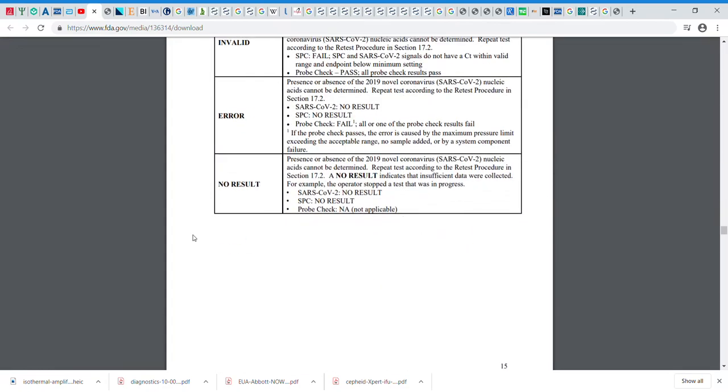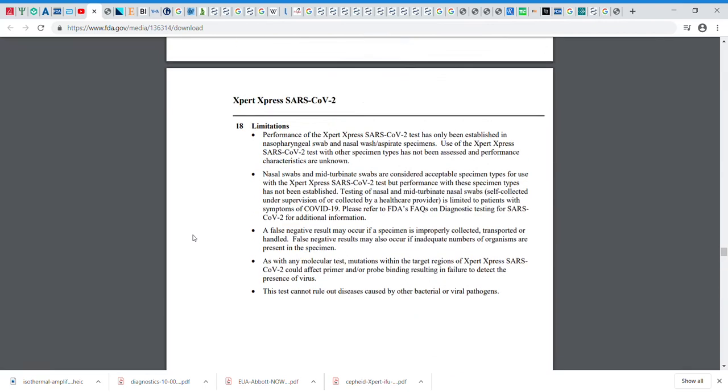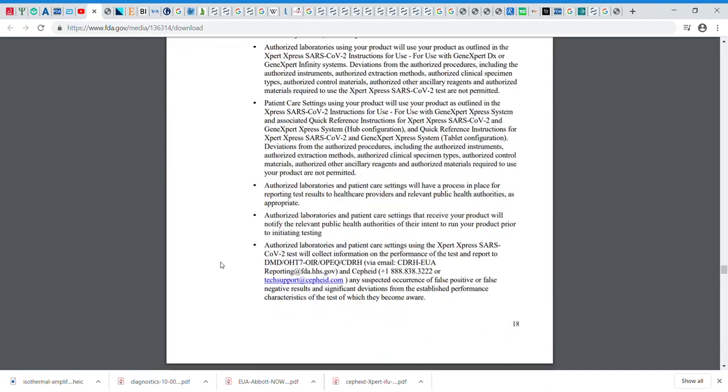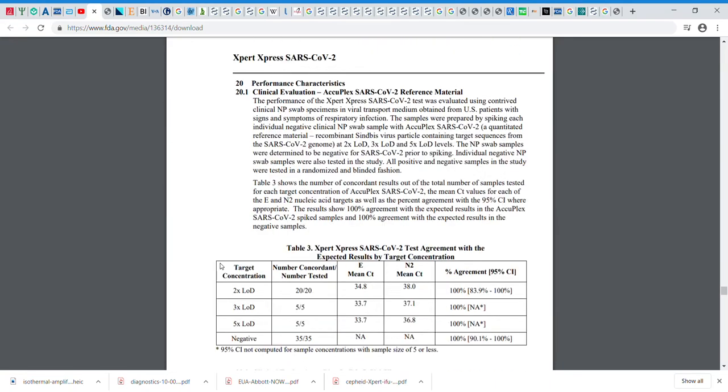And they tell you how to interpret your results, when to retest, how to retest. They talk about limitations, right? About transporting. So for the Abbott test, you're saying now that it's actually not good transported. And so Abbott has actually redone their authorization and saying, no, you can't keep it for days. You just have to run it then and there, because there's been reports that it's not very good if you don't run it then, if you just use the transport medium.